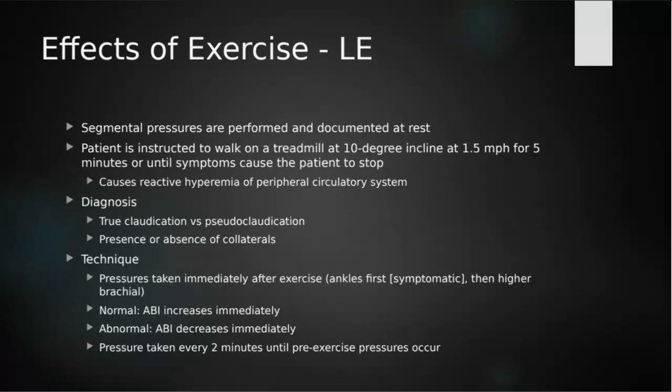So now exercise is going to have a massive effect on how we would perform this exam. So we need to perform this exam at rest. We're keeping our patient supine 20 minutes before we even begin.